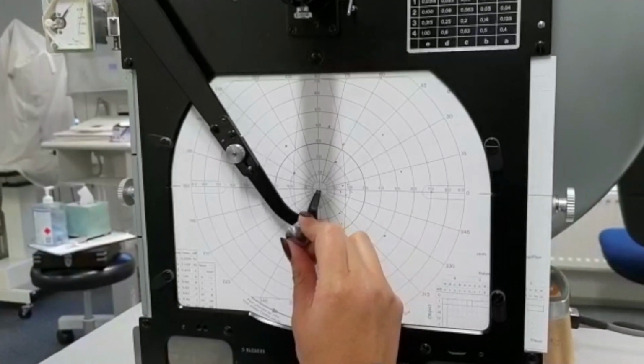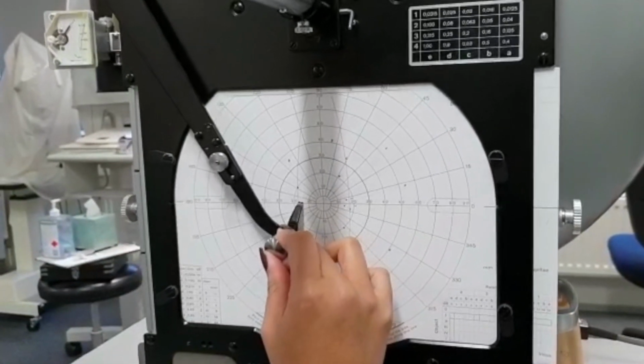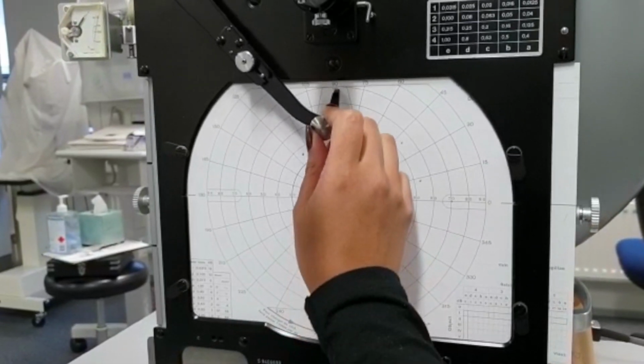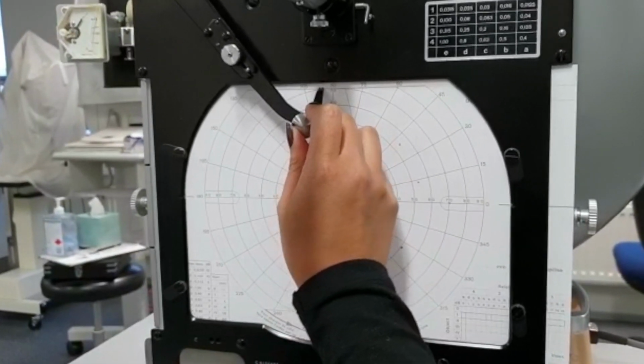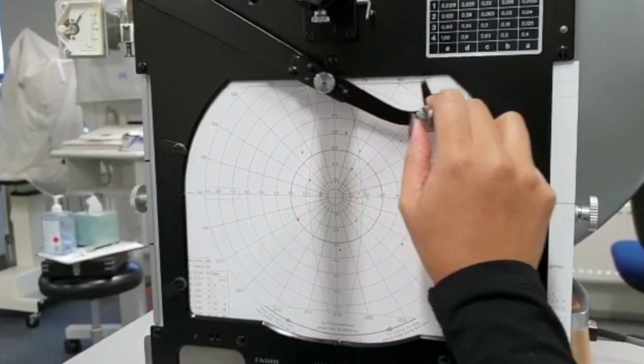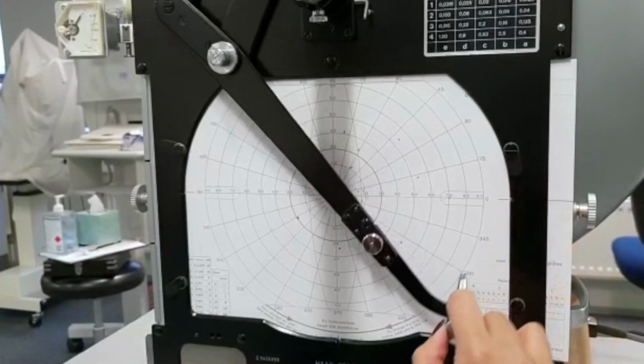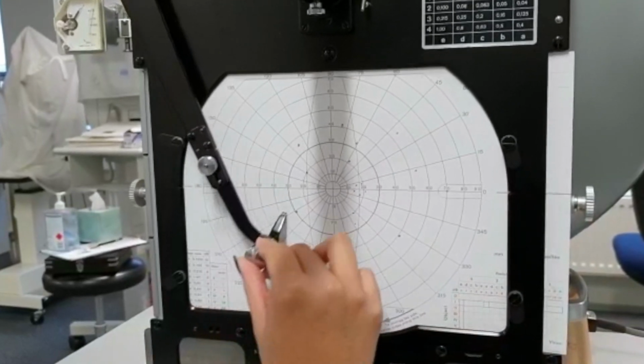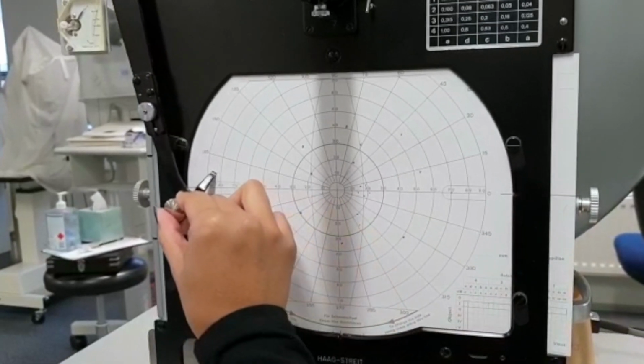The Goldmann is built in a way that the perimetry arm can only move freely in half of the chart at a time. To access the other half of the chart, you have to bring the arm to the very top and proceed to bring the arm out and down, like you are tracing the outskirts of the chart. This way you can have access to the other half of the chart to continue marking your visual field.